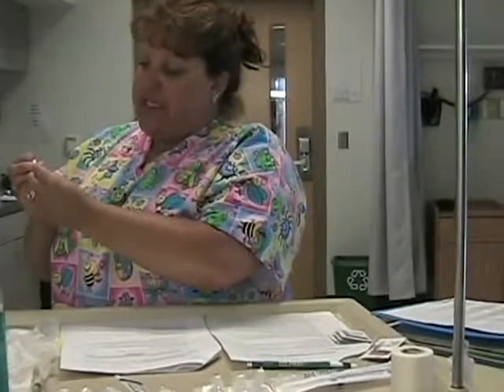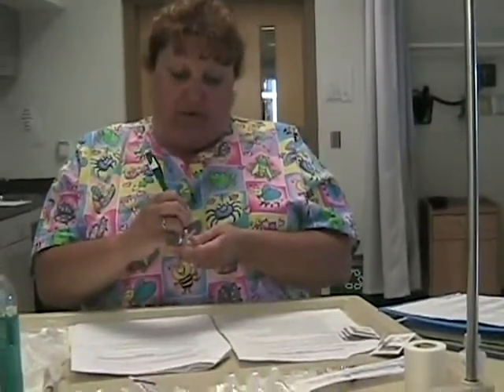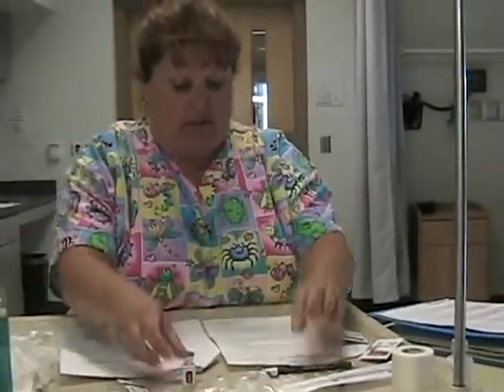First, we need to draw it up. So we've gathered all our equipment, we've checked the MAR, we need to check the expiration date. It does say July of 2012, so perfect. We are within normal for that expiration date. And then we would document the time and date that we opened it, which is July 14th of 2011, because it is a multi-dose vial.